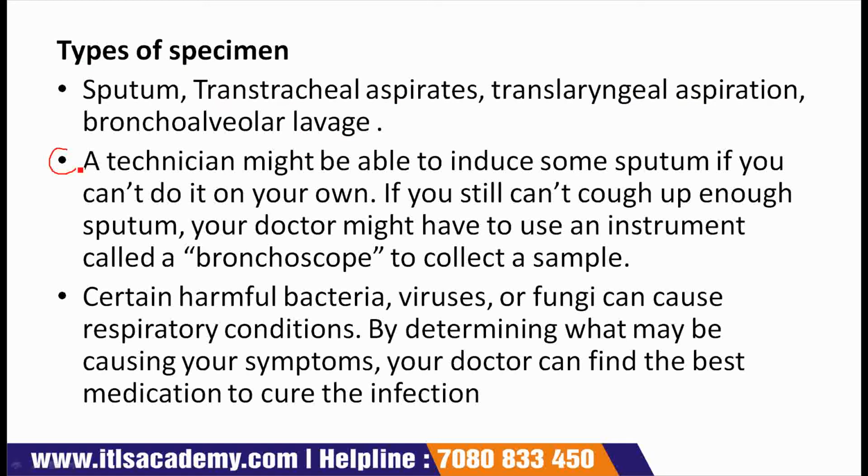Next point is a technician might be able to induce some sputum if you can't do it on your own. If you still can't cough up enough sputum, your doctor might have to use an instrument called a bronchoscope to collect a sample.